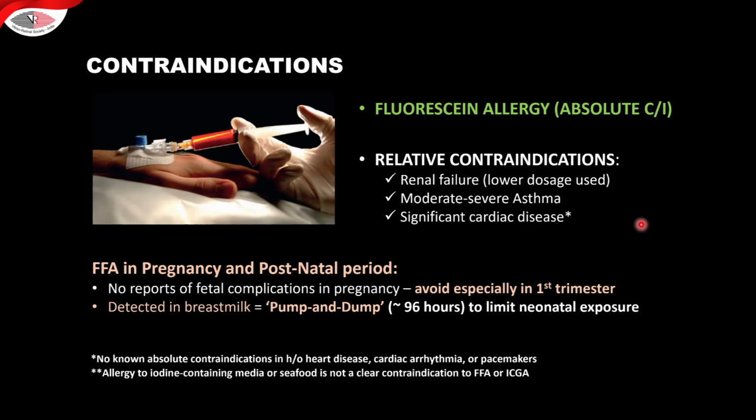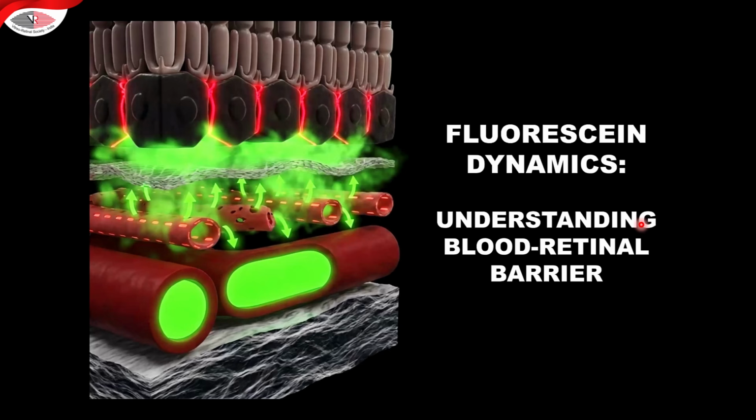In pregnancy and the postnatal period, well, there's no report of a fetal complication, but it should be avoided in the first trimester. It is detected in breast milk, and so if at all it needs to be given, breastfeeding should be stopped for 96 hours after the procedure as a part of the protocol.